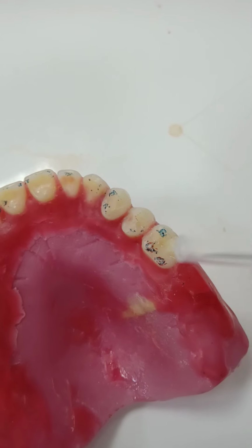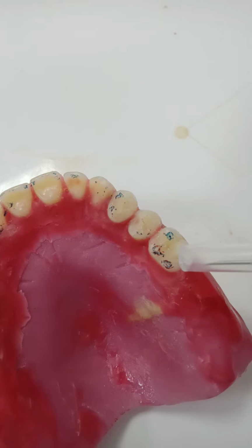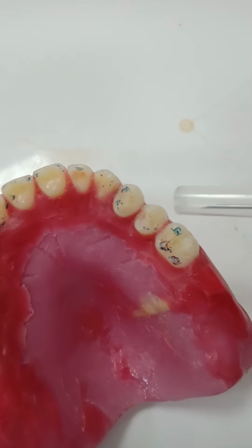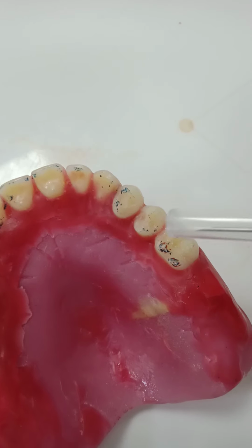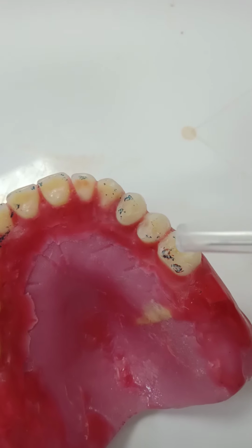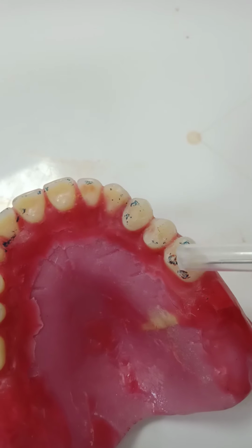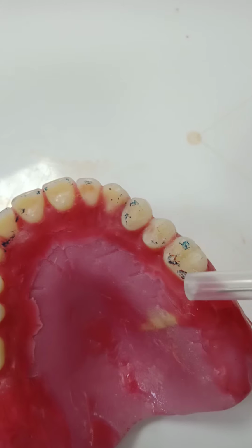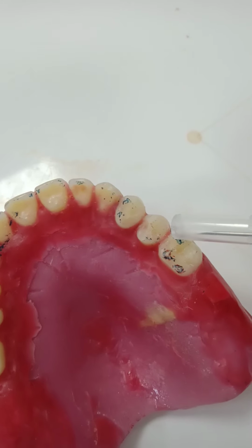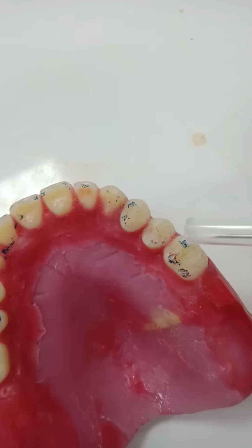Take this out, okay? Just take it out with a knife or scalpel. Just take it off. You will find that there is a hole of wax here. Melt the wax buccally. So the hole is an empty hole of wax. Melt the wax buccally here. Then put the tooth back. Now these will go back to their original position, but this one now is over molten wax. So press it inside.